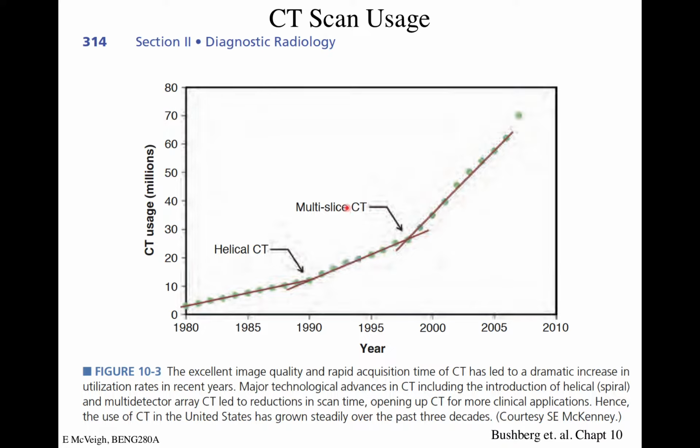And then we started seeing 2-slice scanners, 4-slice, 8-slice, 16-slice, 32-slice. Then it got to 64-slice. And this 64-slice VCT scanner by General Electric was the best-selling medical imaging technology ever, right? The 64-slice CT scanner, because it's just so darn good, right?